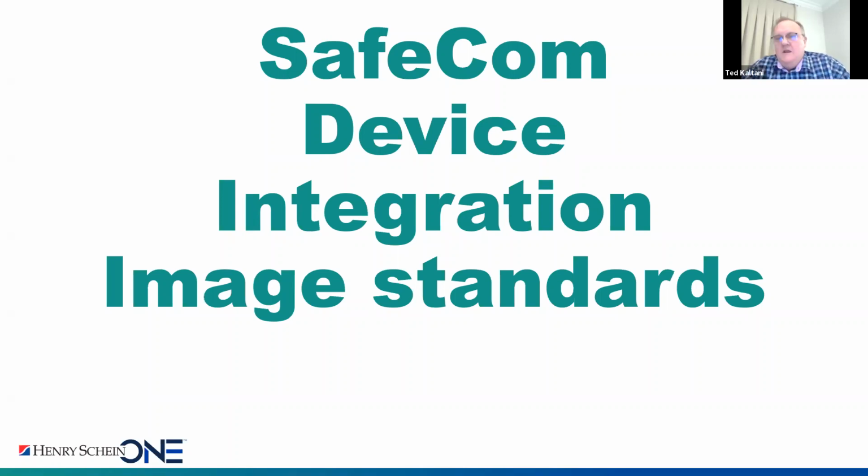So Twain has grown to the point that, with the newest version called Twain Direct, it will allow devices to connect directly to an imaging application without you even having to install a driver. So you can have a device running on Mac, on Windows, on Linux. You can have it running on Android. You can have any device running directly, even on a web service. So you can open something similar to Google, have a little button there that says X-ray, and you can actually take an X-ray.